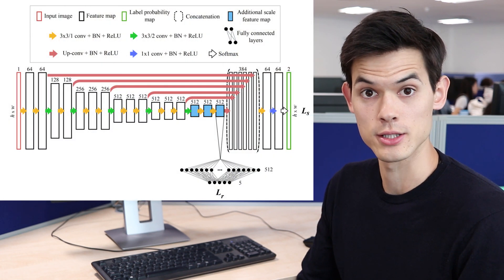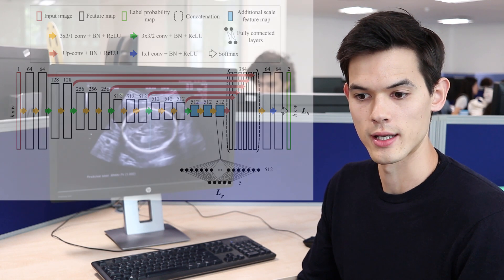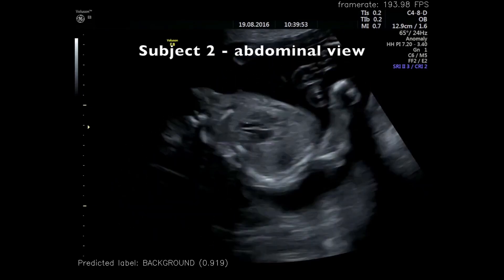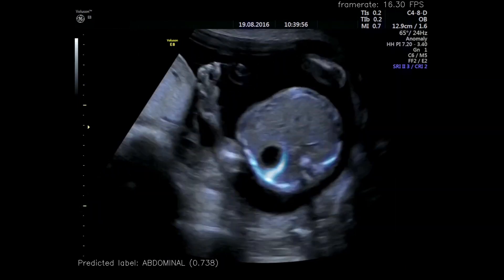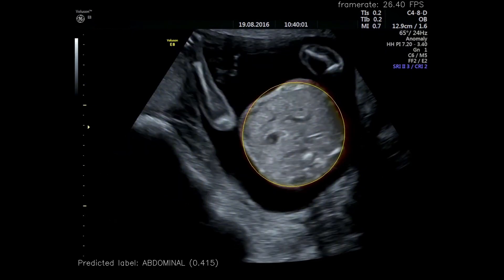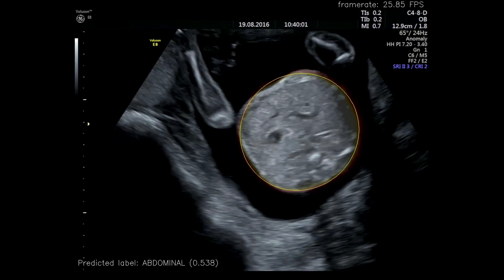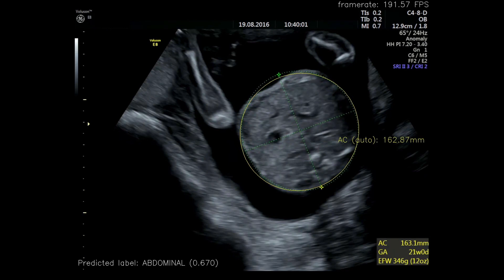We're using a fully convolutional network which gives a pixel-wise segmentation of an image. We've trained it to identify as foreground either the region within the abdomen or the region within the head — there are two separate models. Once we have that region, there's a simple ellipse fitting step which can be applied in real time to these segmentations in order to fit an ellipse and make the measurement that a clinician would typically make using a tool as part of their imaging suite.